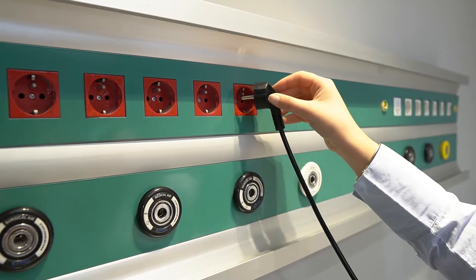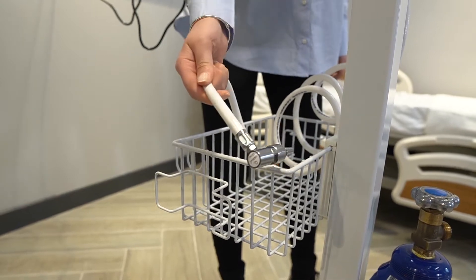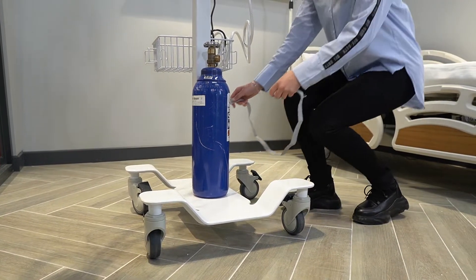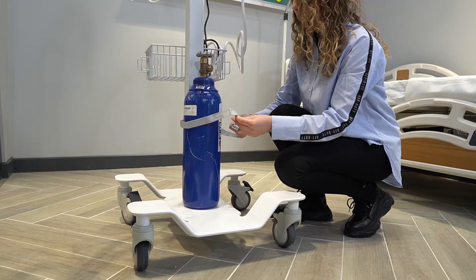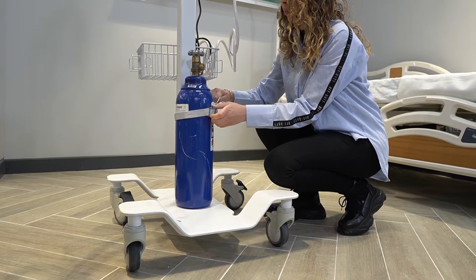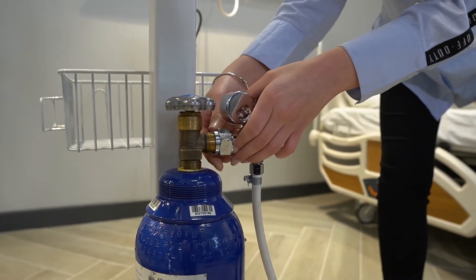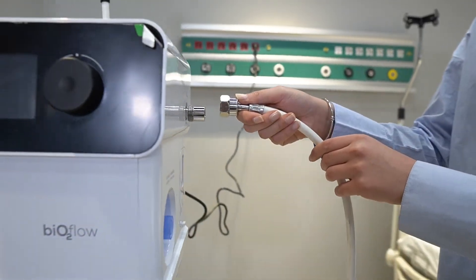The oxygen inlet can be provided by two different methods: one is the central system, and the other is the oxygen tube. The oxygen tube must be fastened with the safety belt as designated. The oxygen regulator is fixed to the outlet of the tube as designated, and the other end is inserted to the oxygen inlet of the device.